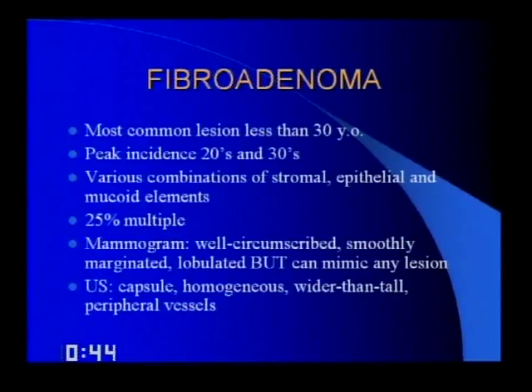And by ultrasound, they should have a capsule, homogeneous, wider than tall, with peripheral vessels draping over it. As far as the shadowing, most of the time there is neither acoustic shadowing nor enhancement, but I've seen both within fibroadenoma.